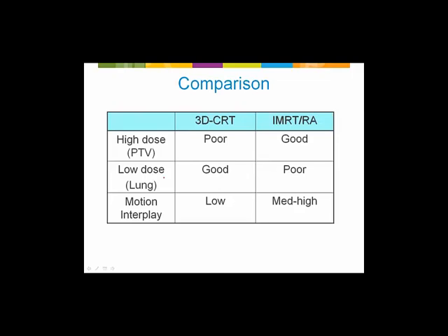It's very sensitive. Okay, so what if we could extract the best of both of these? And I think that's where some of these hybrid techniques really shine. So what is hybrid IMRT or RapidArc? It's a technique that was initially introduced for breast by Charles Mayo when he was at the University of Massachusetts. What we do is deliver the majority of the prescribed dose per fraction by just static open fields, and we'll call this component the base dose. Then the remainder of the dose per fraction is topped up with some IMRT or RapidArc.